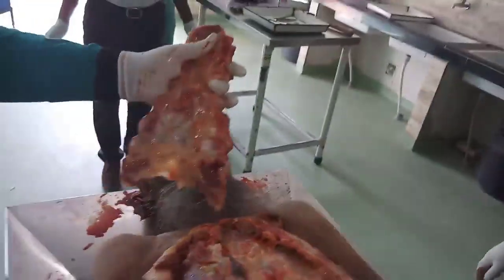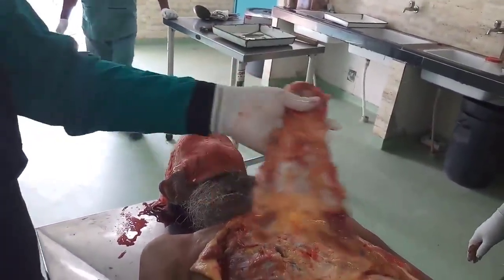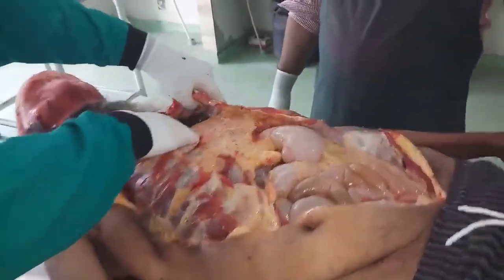So this sternum along with costal cartilage, that is sternal plate, is removed. Now in the chest cavity, we can see the lungs.